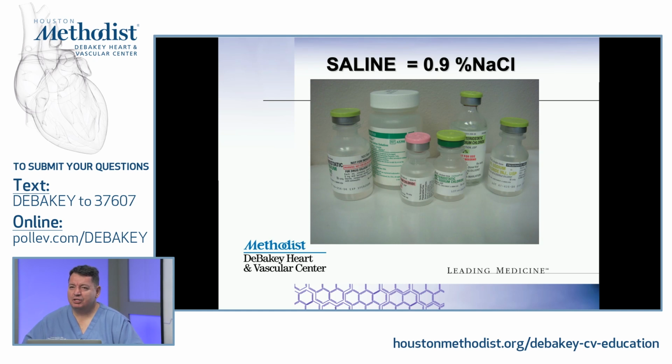Oh, I have a question. Can you detect bubbles in other vascular areas other than the heart? Oh my God, very good question. At the end, I will come back. I need to show you a slide or two. Indeed, if you pay attention to your carotid ultrasound studies and you decrease the gain, increase your sample gate, you're able to see bubbles shortly after the cardiac echo.